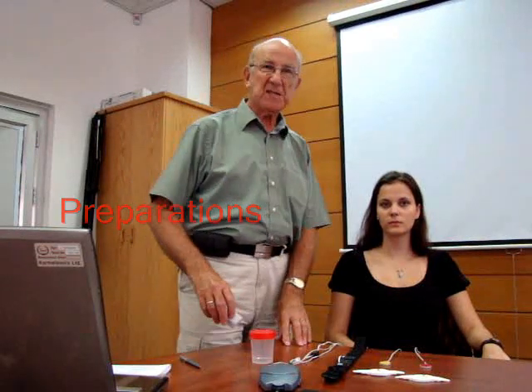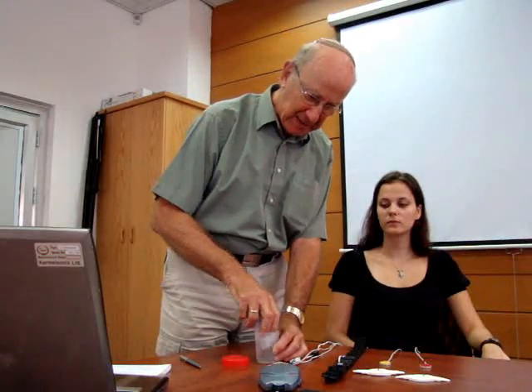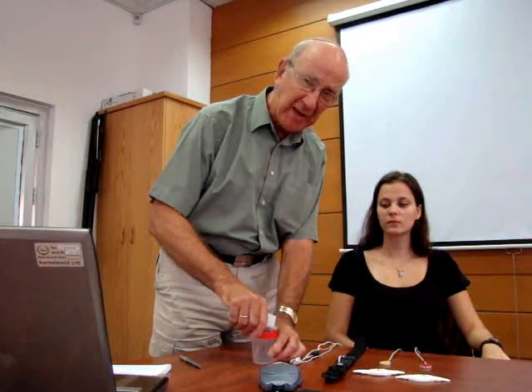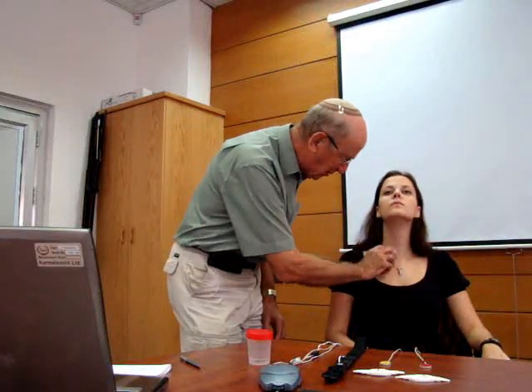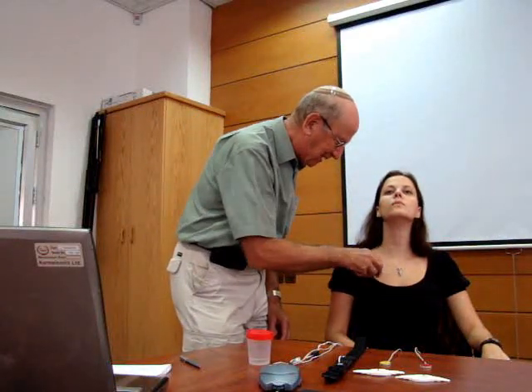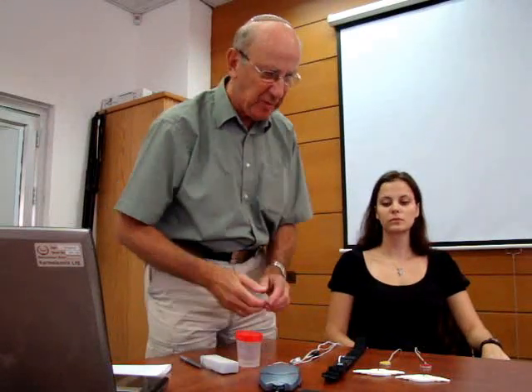We're now going to show you how to place the sensors correctly and to check that we're getting good signals so that we can make a recording. The first thing to do is to clean the skin where the sensor is going to be placed on the neck and on the chest to make sure there's good contact. I'll clean the skin slightly like that, and here on the chest, so we now have a suitable area.